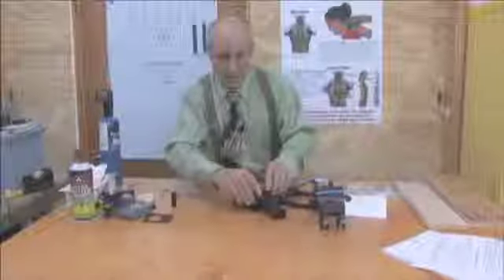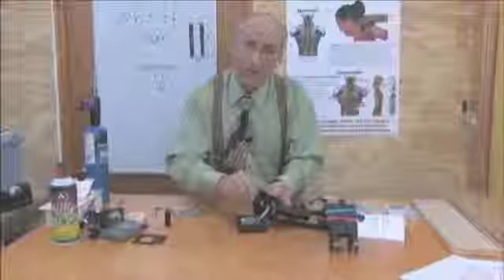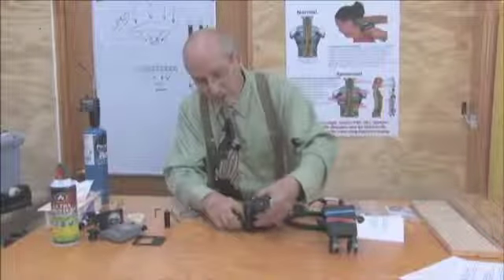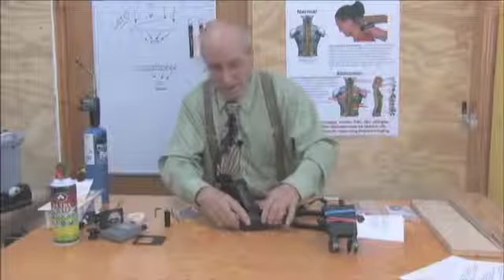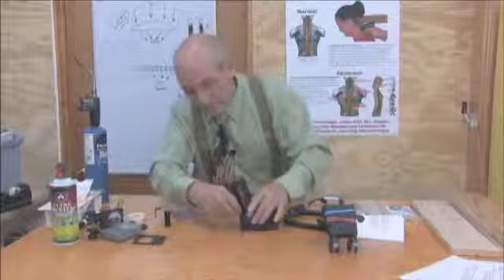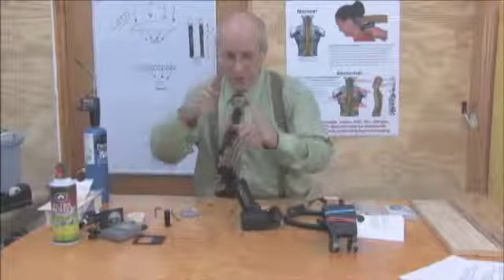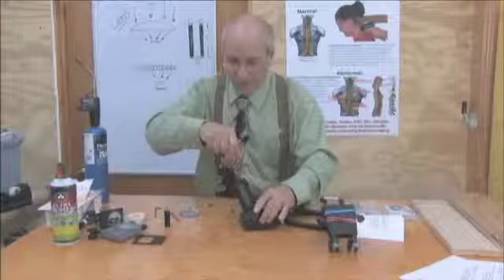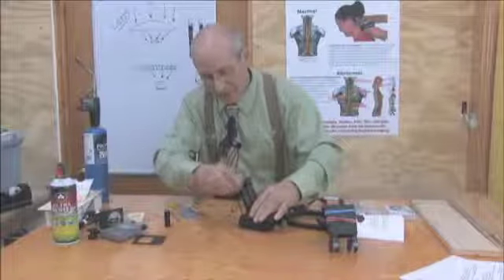Very carefully, the gasket has a large opening, and we very carefully place the wires so they fold back inside and everything is flush. Take the new screws, and I'm going to use this ball end hex driver, but the one that comes with the scanner also works very well, just not as convenient.